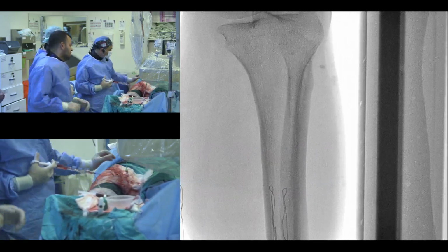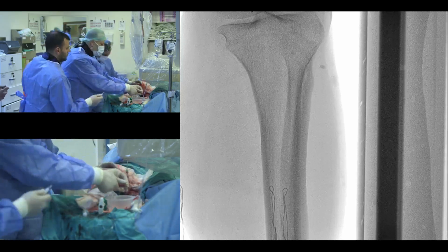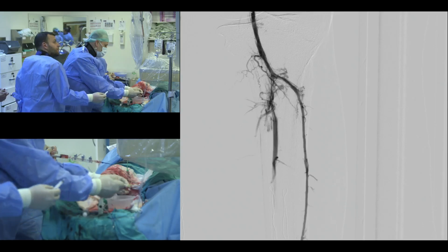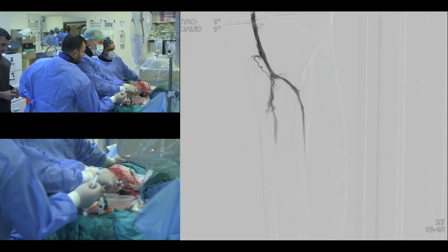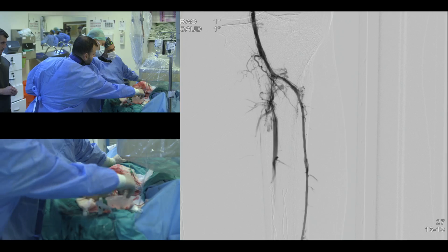But if you're coming contralateral, you want to put your sheath as far down into the SFA or popliteal so you don't give too much contrast, and the definition of below the knee vessels will be much easier. So I always suggest 6 French, 65 or 90. But if you are antegrade, then use a 45 centimeter. And then the rest, as explained yesterday, we use a measuring tape and a rad pad to protect from radiation.